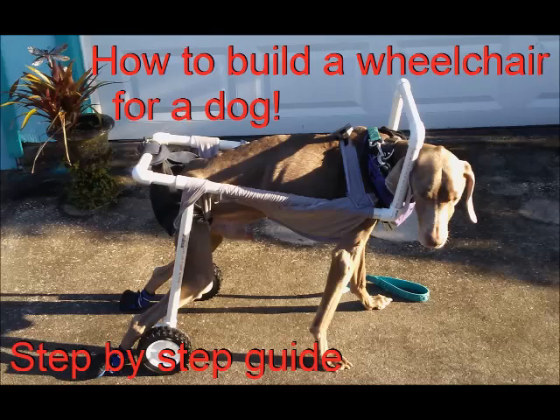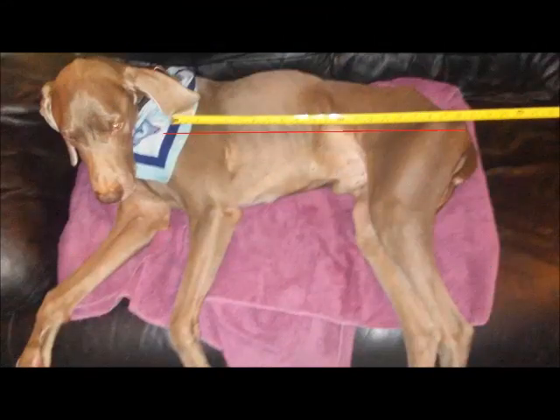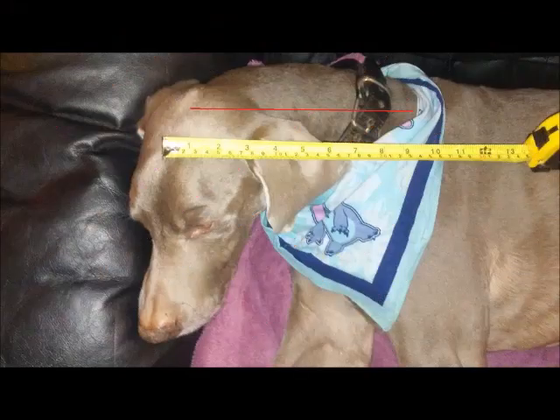Start off by taking the measurements of your dog. You want the length of your dog's body, the height of your dog's body, as well as the full length of your dog's neck.